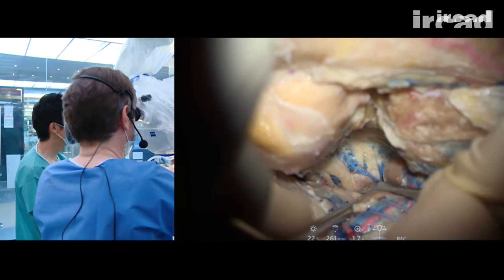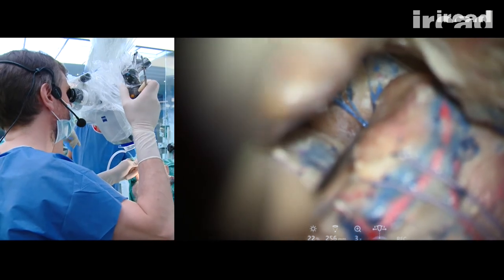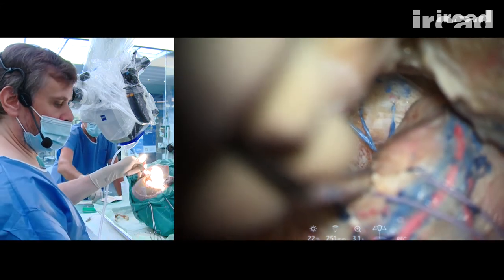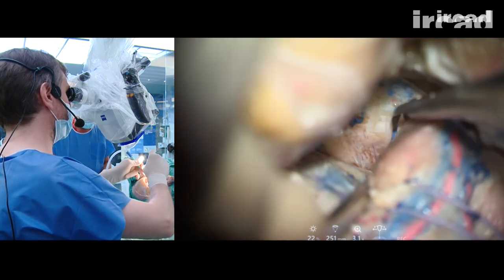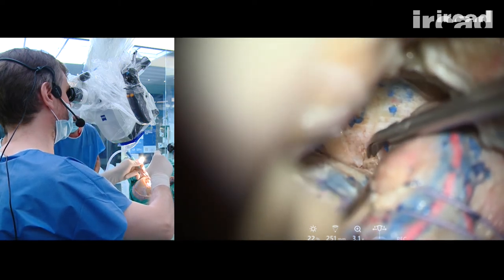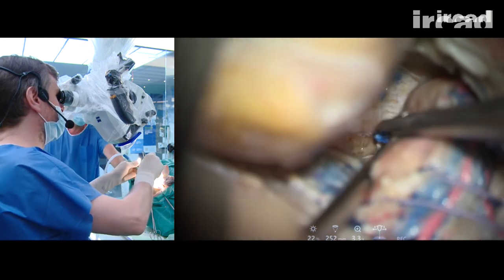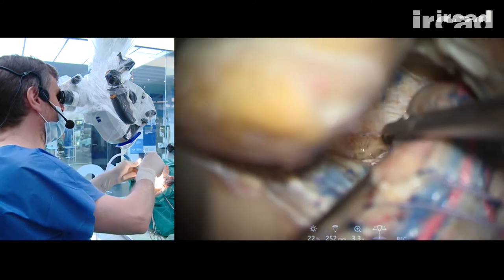With here, we start to see Meckel's cave, deep here. This is Meckel's cave. We can see that there is some fluid. See the micro shear. I think we could do a slight opening of Meckel's cave here. This is Meckel's cave, on the fibers of cisternal segment of trigeminal nerve, sorry.